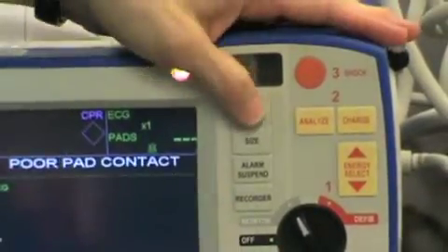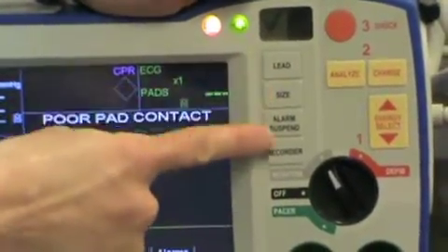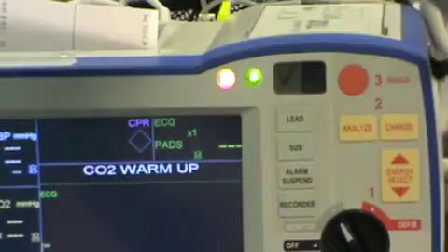So you need to change the lead to tell it to look for the electrodes instead. You might adjust the gain by using the size button. The other 2 buttons on here are to shush your alarms and to print a strip. That's about it on the monitor side.